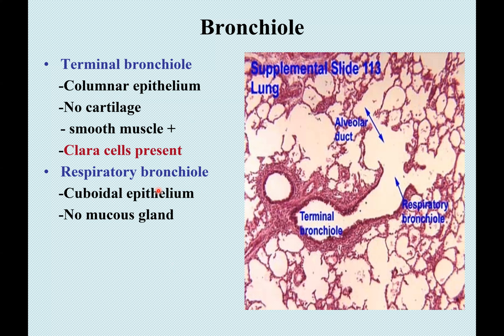I've explained that. One beautiful thing when you read the respiratory part is that there should be no mucous glands. So there should be no goblet cell or anything. The reason being that this place is so small. And when you begin to have mucus in there, it will obstruct the movement of air into the alveolar. And that becomes very problematic. So this is how you look at the histology when it comes here. So at this terminal bronchi, you are expecting to see simple columnar cells which are non-ciliated. They are not ciliated. Okay, this is the respiratory.